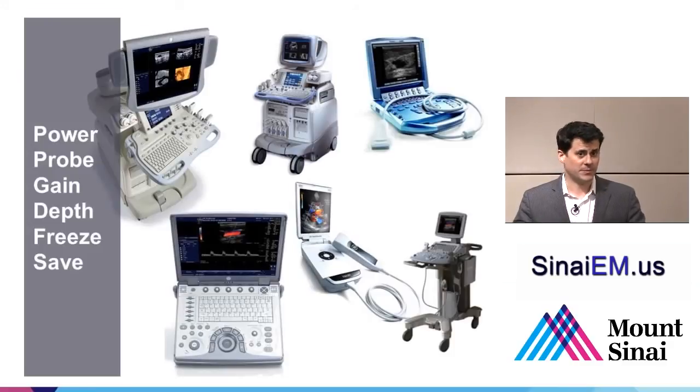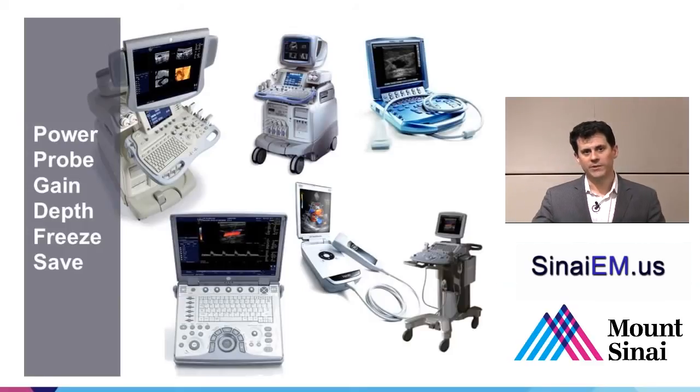There's always going to be a button that helps you select which probe you're going to choose, except with some of the machines that only have a single probe attached to them. Gain and depth are the next two, and they're really the most important. You're going to use gain, which has to do with how bright the image is going to look, and depth, meaning how large and deep your image is going to look. Continuously, you're going to use gain and depth as often in ultrasound as you use volume and channel on your remote control at home watching television.